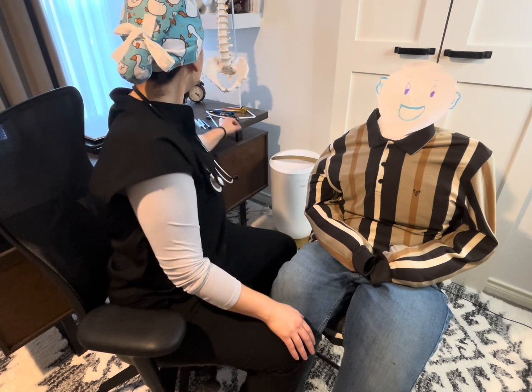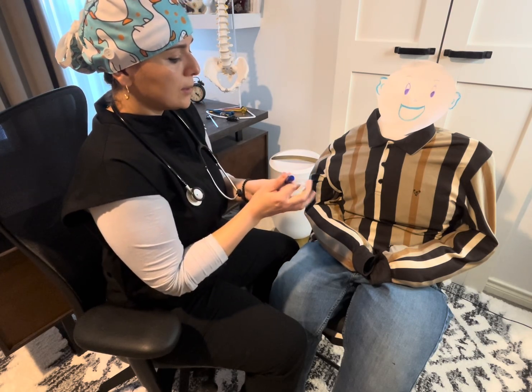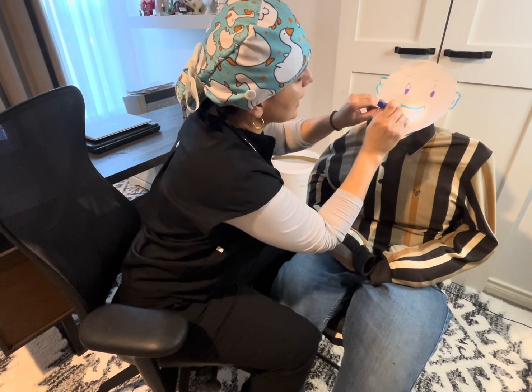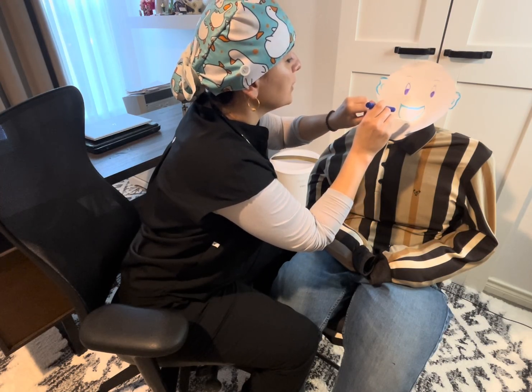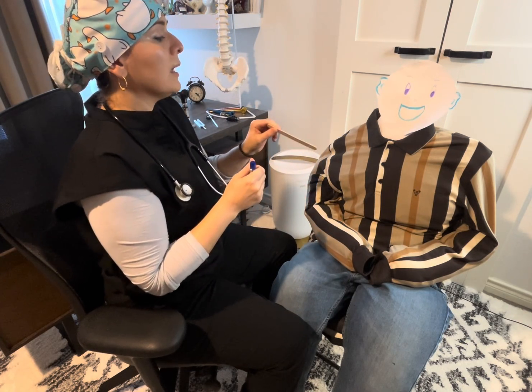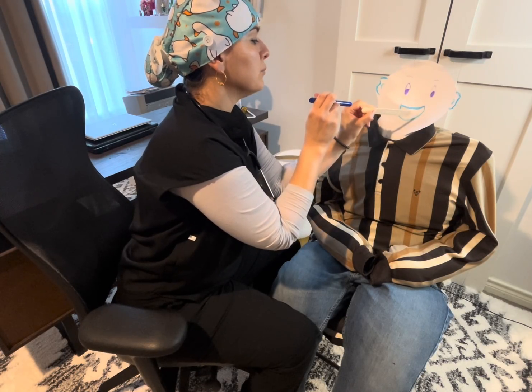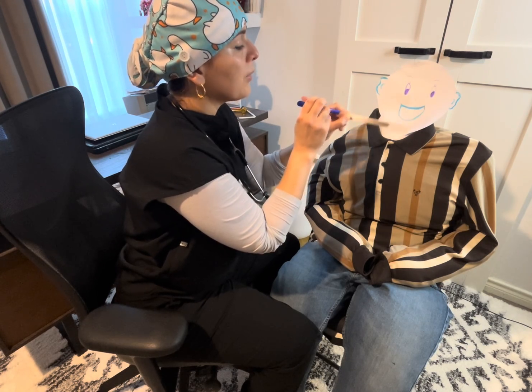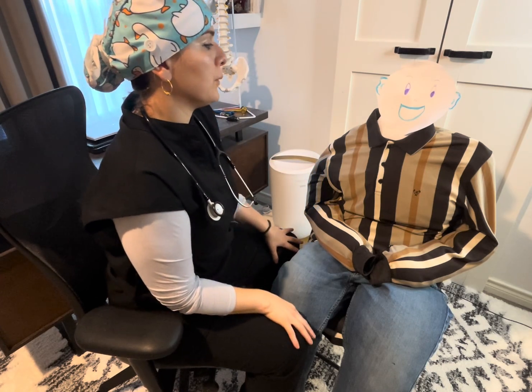We use a pen light and a tongue depressor. I ask my patient to open wide and say 'ah.' I can then check the tonsils, the soft palate, the tongue, and the throat for any inflammation. We also use the tongue depressor to move the cheeks to the side to see the sides of the mouth and make sure everything is patent with no ulcers.